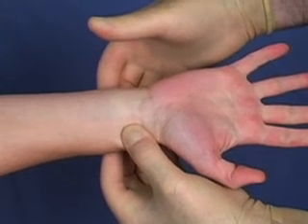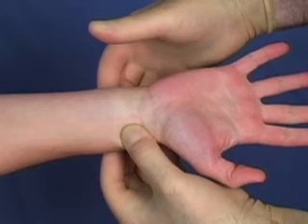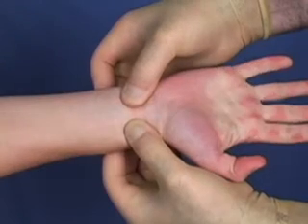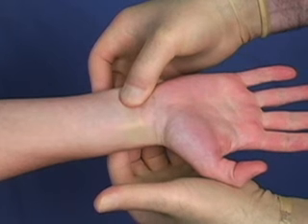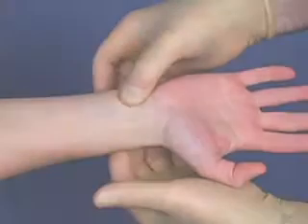Circulation should return to the extremity within five seconds, with delayed return suggesting poor collateral circulation. The test should then be performed on the radial artery circulation in the same manner.